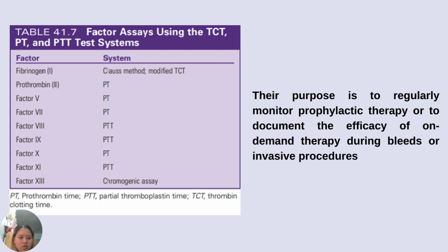Their purpose is to regularly monitor prophylactic therapy, or to document the efficacy of on-demand therapy during bleeds or invasive procedures.